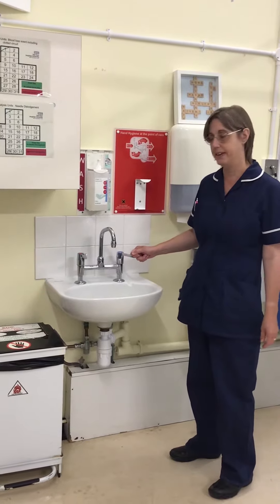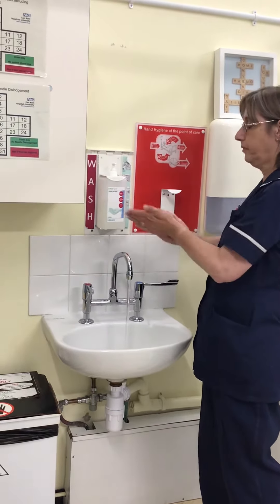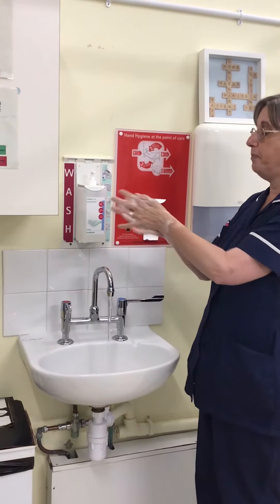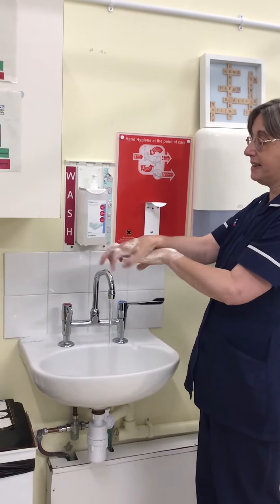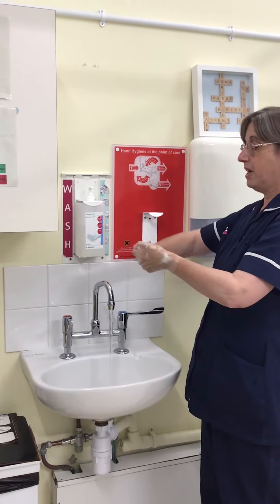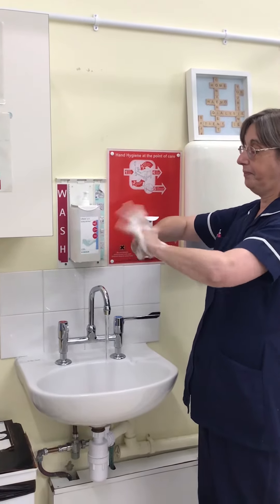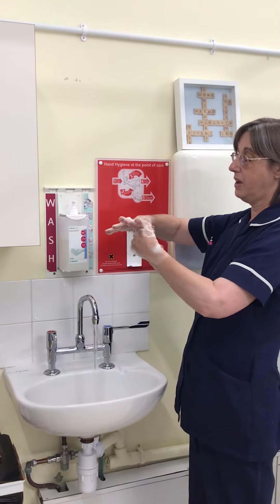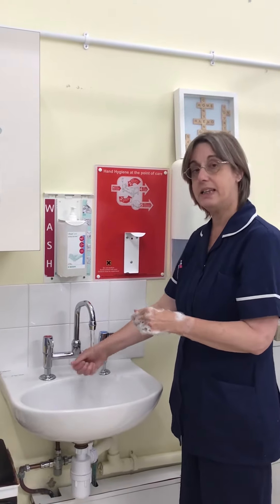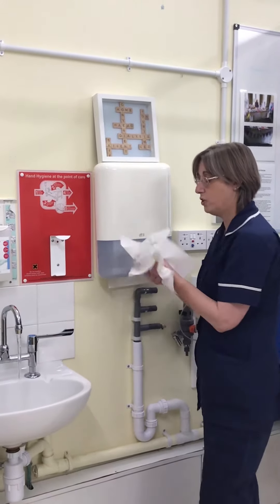Always wet your hands first before applying soap. You need to wash your hands palm to palm, do the backs of the hands. Bracelets and watches we request you remove, but rings you can always move and wash around. Then do the backs of your knuckles, the thumbs separately, and also the spaces in between, and rub the fingertips into the palm of the opposite hand. Repeat the process two more times, then use your paper towels to dry your hands.